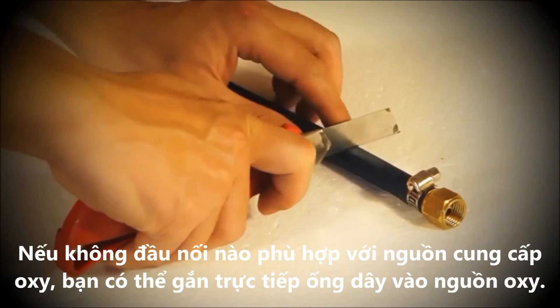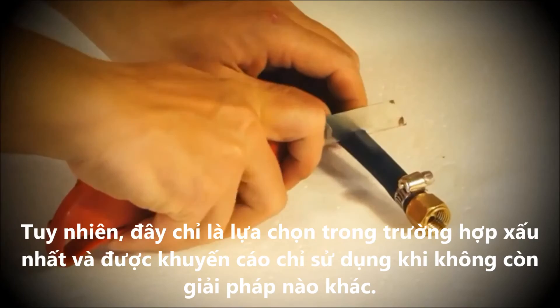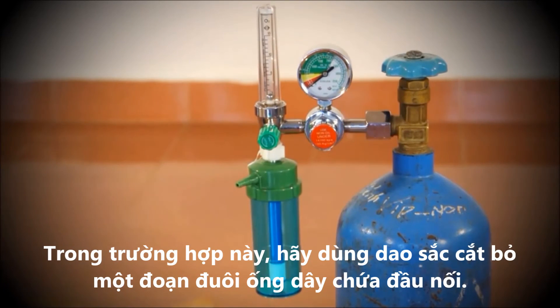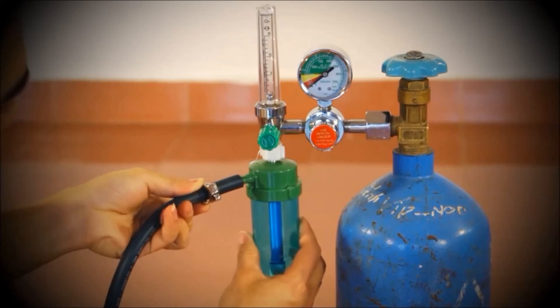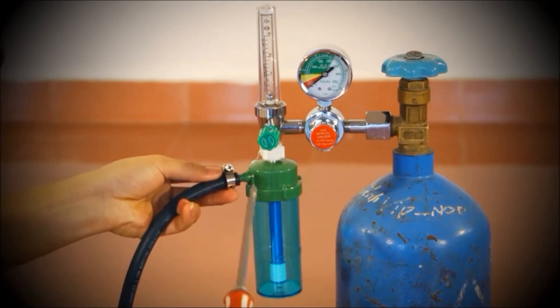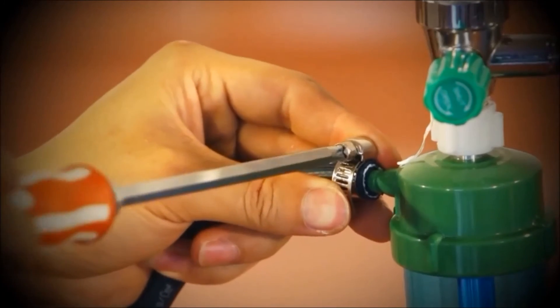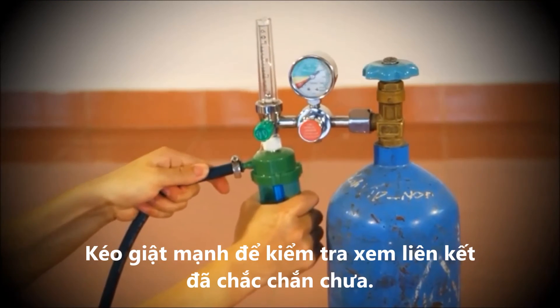If none of the connectors fit, you can clamp the hose directly to the oxygen source. It's a sub-optimal solution and not recommended unless there is really no other choice. In this case, cut off the attached connector with a sharp tool. Do not remove the humidifier from the flow meter. Instead, remove the ring clamp from the plastic bag and slide it onto the hose. Connect the hose directly to the humidifier nozzle and position the ring clamp at the end of the hose. Using a Phillips head screwdriver, tighten the ring clamp and tug to make sure it is secure.